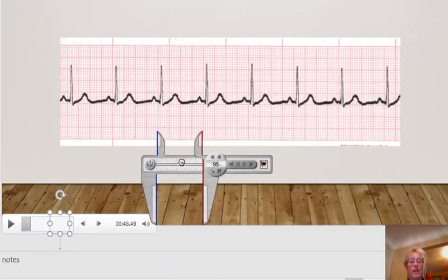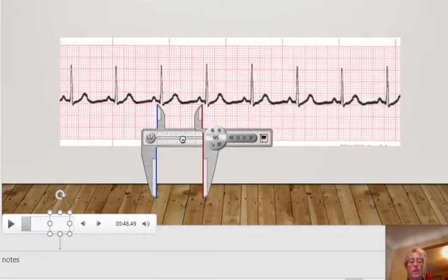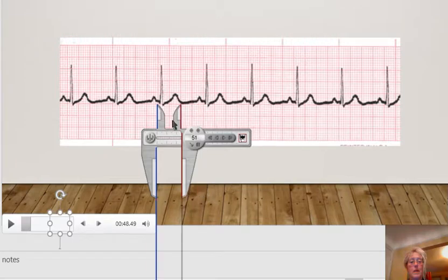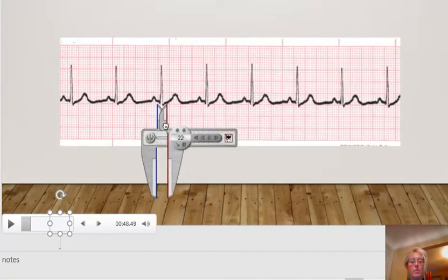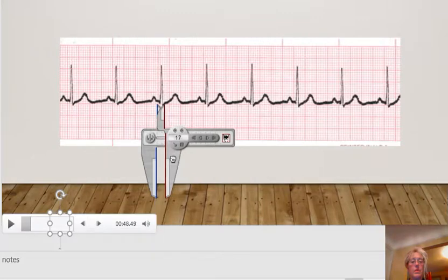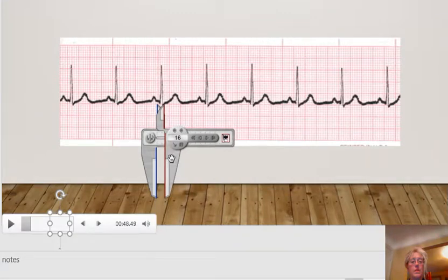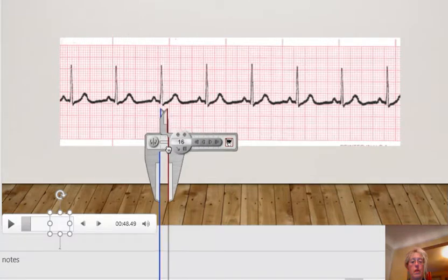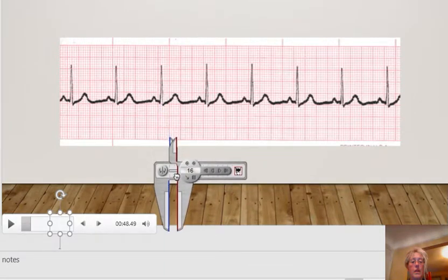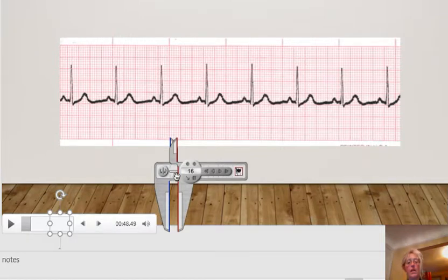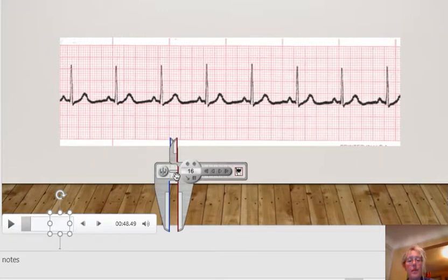So next is to look at our QRS complex. Line it up on the Q and bring it to the S. So it's lined up with the S. That's our QRS. We'll bring it down to a vertical line and count the boxes. So we've got about three, approximately three boxes. So we've got approximately 0.12 seconds, maybe a little less. So that works out.